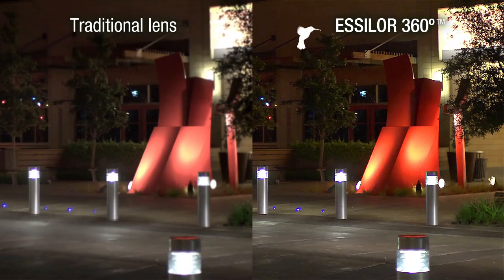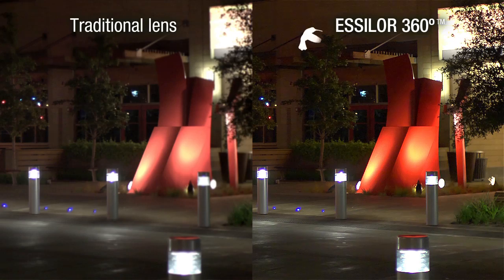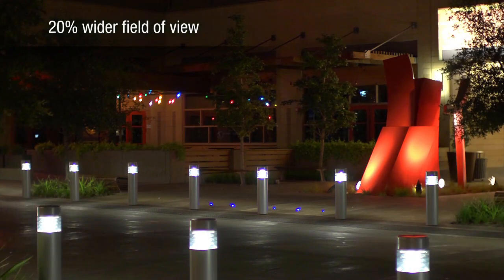Increased contrast helps deliver superior sharpness in low-light conditions. And Essilor 360 lenses feature 20% wider visual zones, almost like you're not wearing lenses.